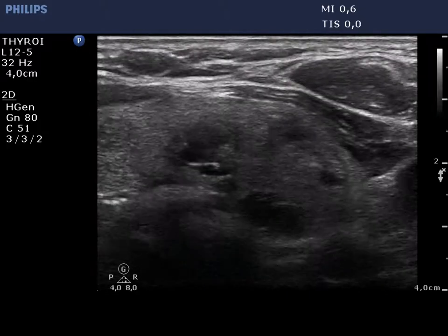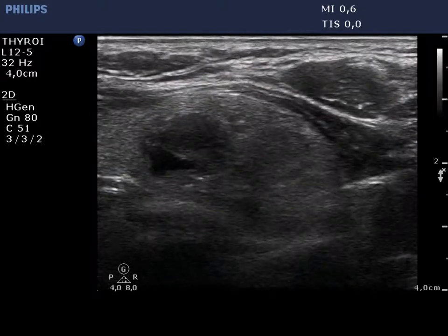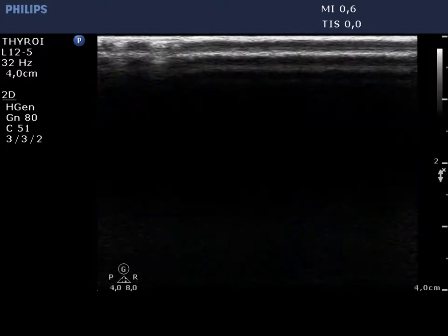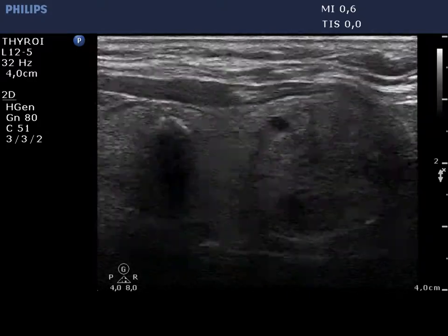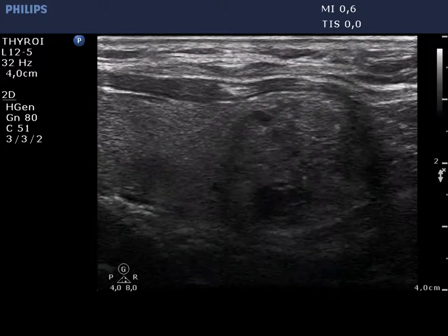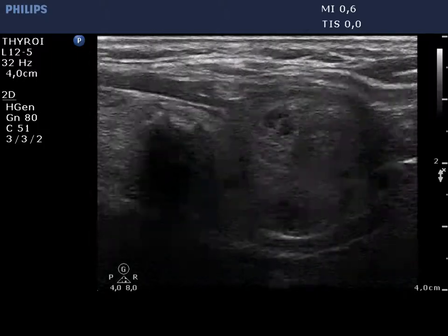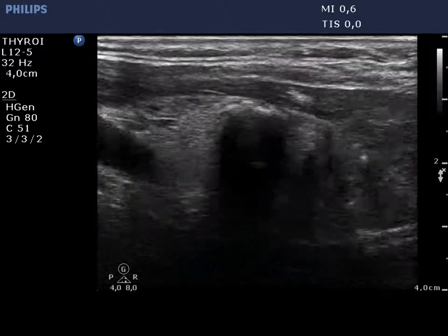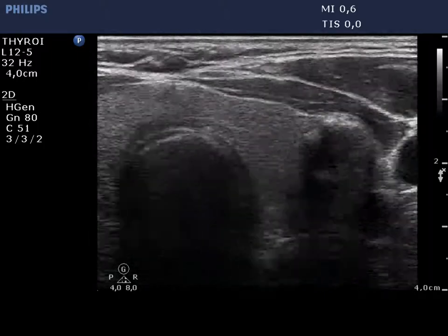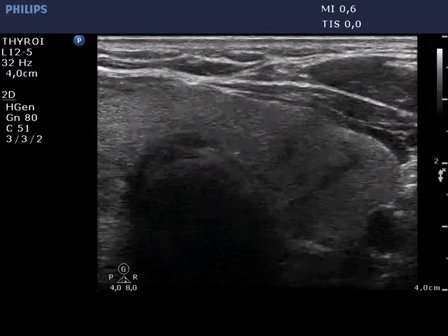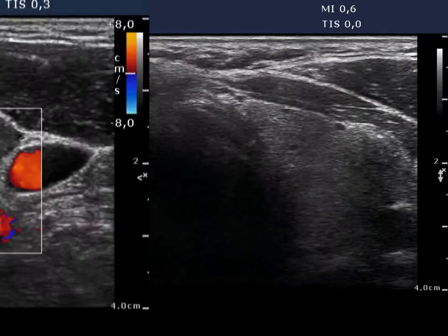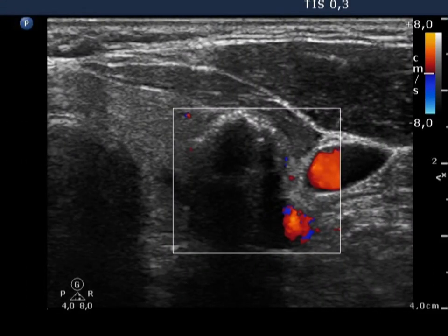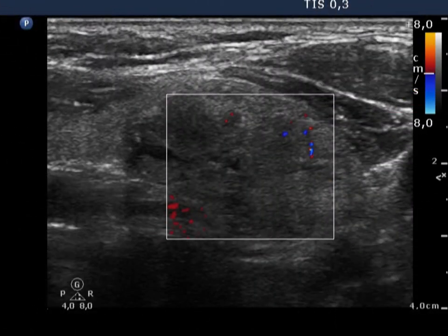The left lobe contains multiple nodules. The lesion in the middle part displays coarse calcifications, while the other one in the lower pole is minimally hypoechoic and inhomogeneous. The vascularization of the nodules in the left thyroid is not specific.